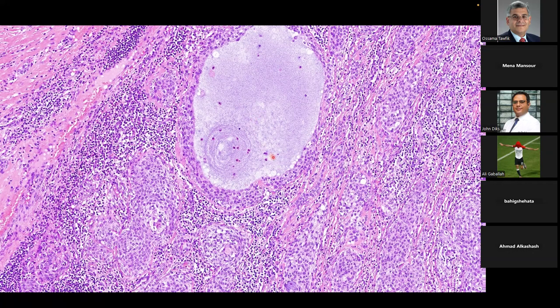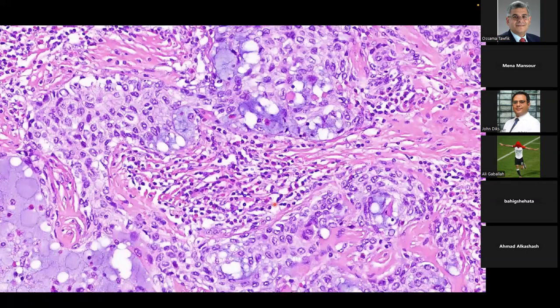But if anything, you would think maybe, oh, is this a metastasis or is this anaplastic thyroid carcinoma? But you could see here it has a background of fibrosis and inflammation. On higher power, again, you look at these inflammatory cells and you notice there's a lot of eos, right? A lot of eos, a lot of fibrosis, eos here as well. But the weird thing is, it's very unusual. You have these mucin cells right in here and mucin pools.